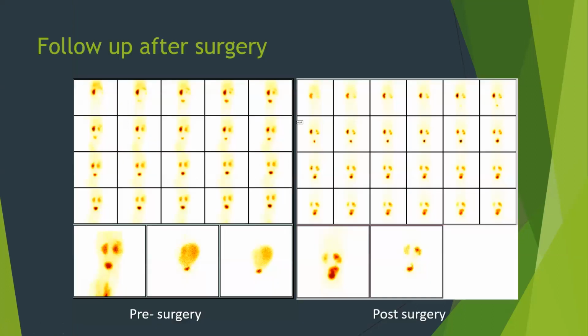This is a case showing follow-up after surgery. The initial images are the pre-surgery pictures, and the second set of pictures are after the surgery, and we can see there is significant improvement in the cortical function and the drainage pattern on the right side.